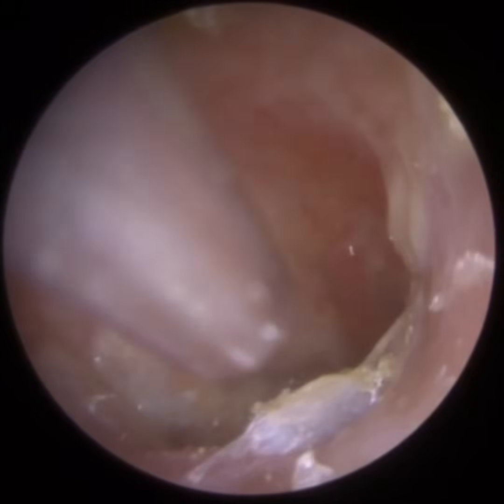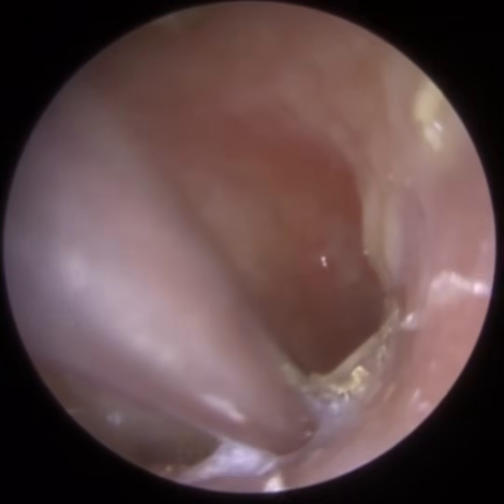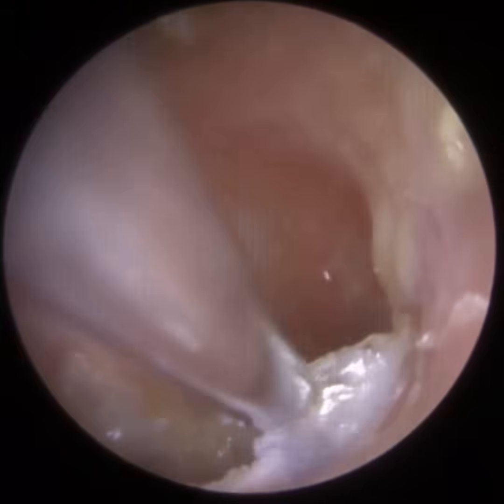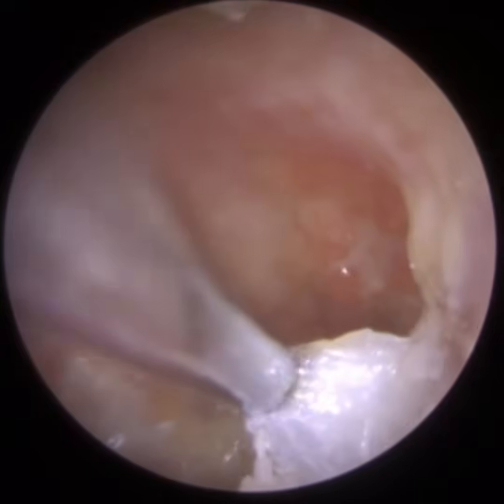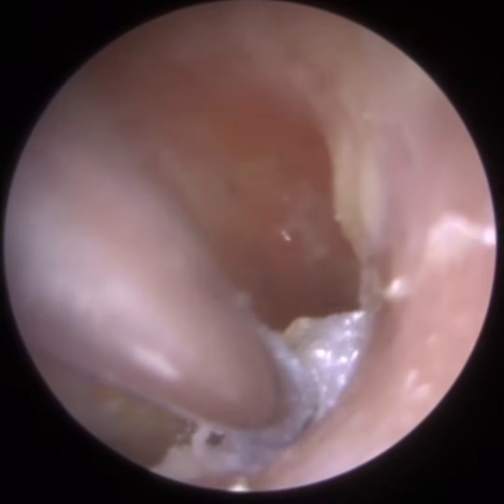So this skin, the ear canal goes up and the skin, then the ear canal goes down. This skin's lining the ear canal and it suddenly drops down in this trench. And I managed to gently peel it. And again, we're just going to be so careful. Don't want to touch the bony part of the ear canal. If I do, it's going to be really uncomfortable for the patient.